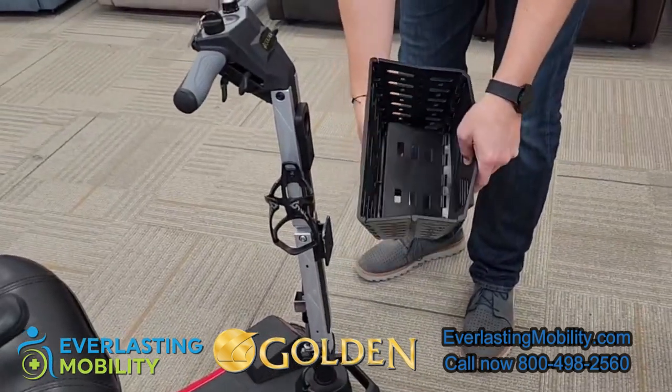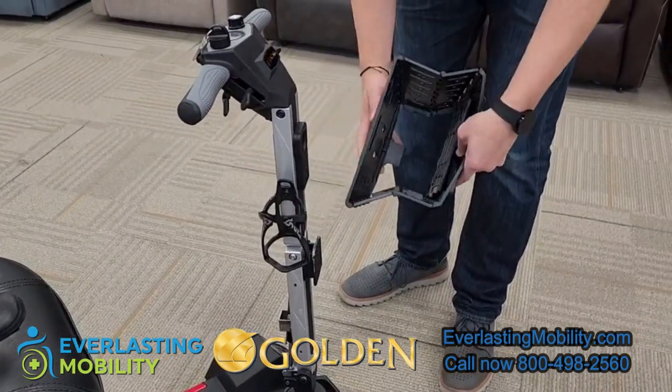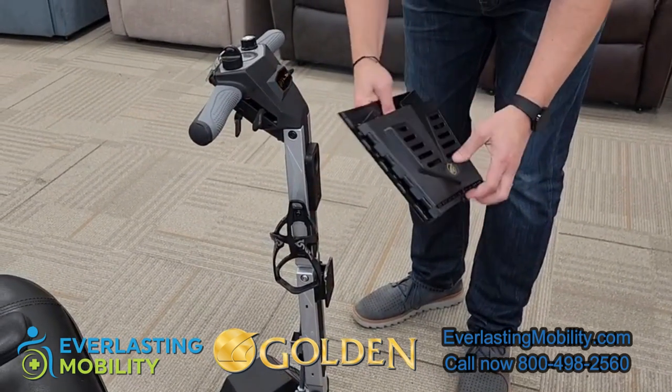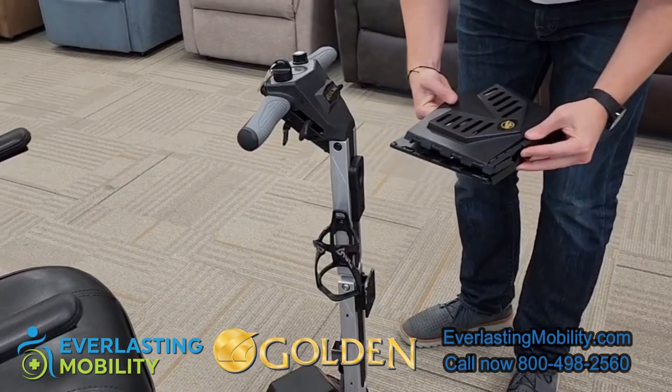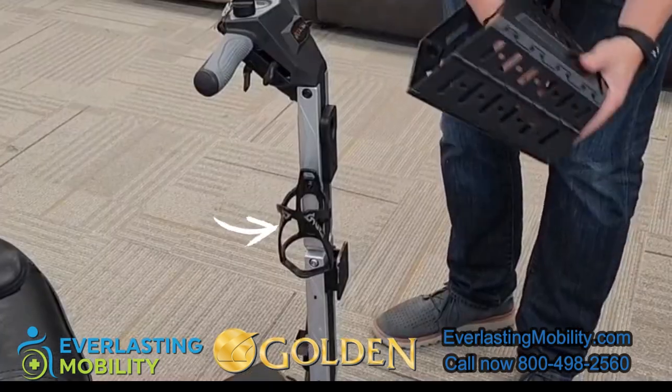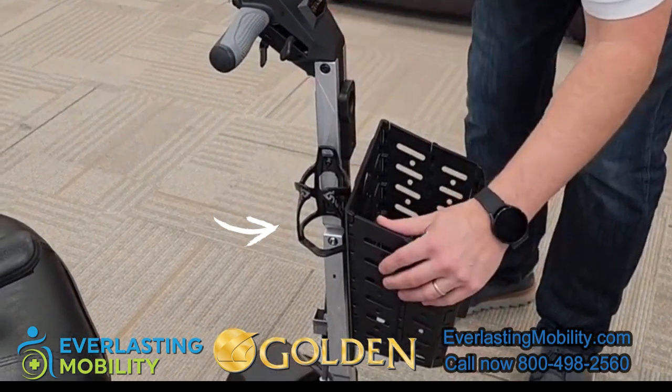On the tiller there is a front basket which you can easily remove — it's actually collapsible so you can fold it into a pretty small size. You can put it in your carry-on bag when traveling and then simply unfold and slide it right back on. There's also a cup holder that comes standard on the tiller.